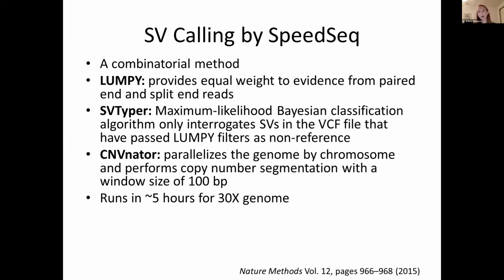One of the advantages clinically is that it runs pretty quickly. This is something where we can't really afford to be churning through our genomes in long periods of time, because they're often fairly rapid clinical questions that they need to answer with this assay.